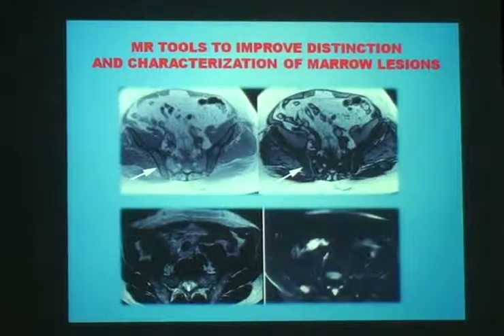There is also the fat suppressed sequence, which has the diffusion weighted images, which help in pinpointing lesions that could be indistinct or not appreciated on the other conventional images.